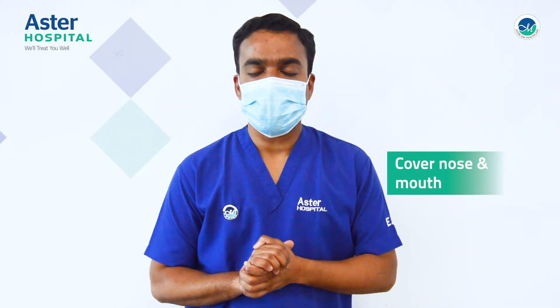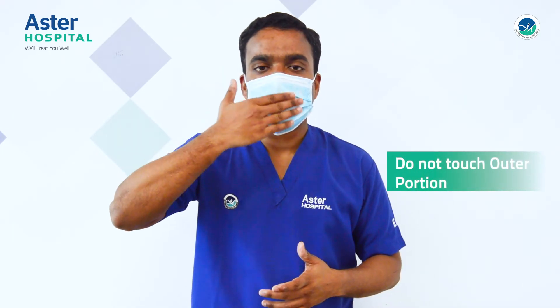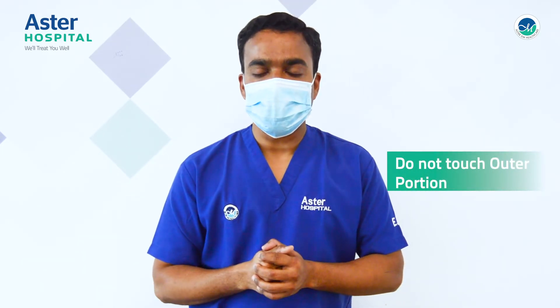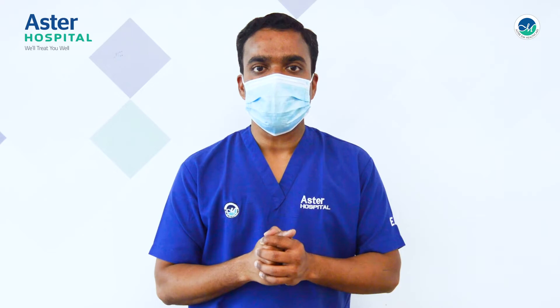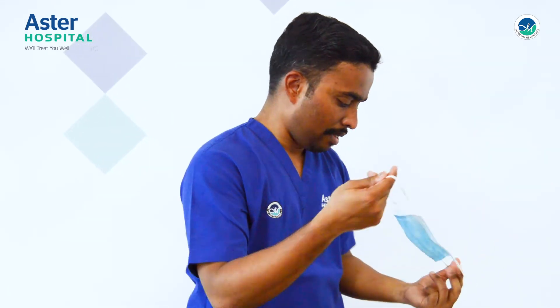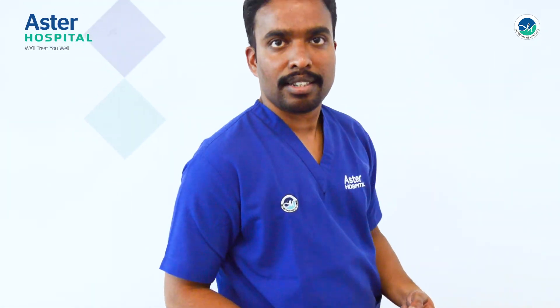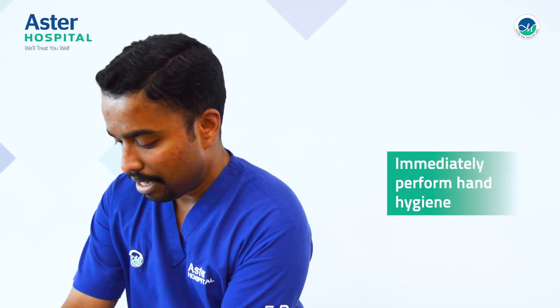How to remove the mask? When removing the mask, make sure that you are not touching the outer part because the outer part of the mask is contaminated. You have to catch the strap to remove it. Then discard it into the medical waste and perform hand hygiene.